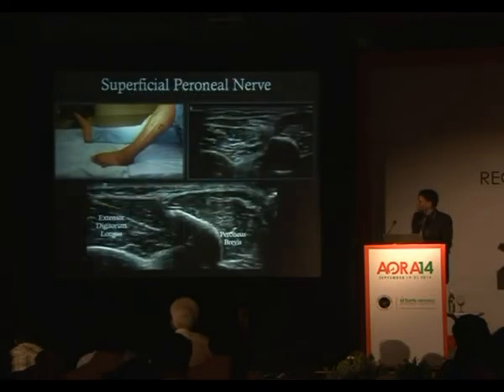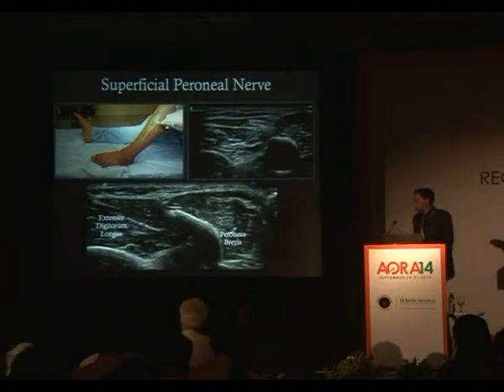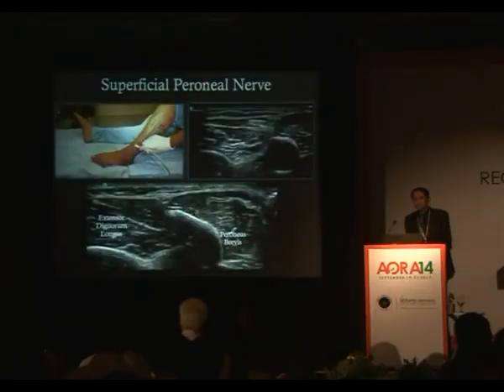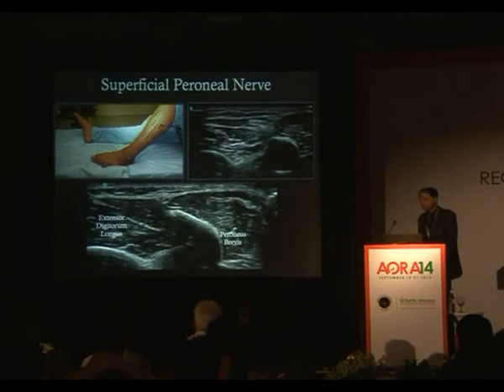The superficial peroneal nerve, like I said, this is the one nerve that doesn't have a consistent vascular landmark. So I like to change the position of the patient, keep the leg this way. And there are two muscles you're looking for, the extensor digitorum longus and the peroneus brevis. And if you scan between them, you're going to look for this sort of picture. Now, how do you identify which muscle is what? The peroneus brevis has a very distinctive sign inside it. You see this little thing there? This is the tendon of the peroneus longus. It's almost always there. So it's very easy to identify the peroneus brevis. Beside it lies the extensor digitorum longus, slightly anteriorly.